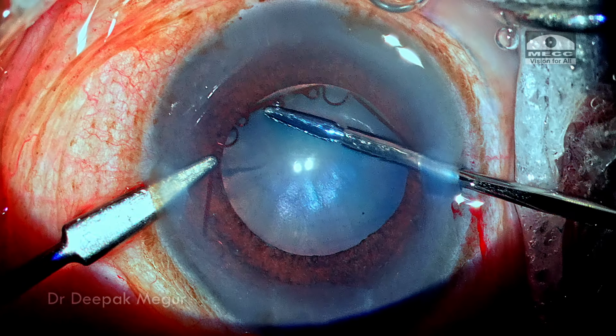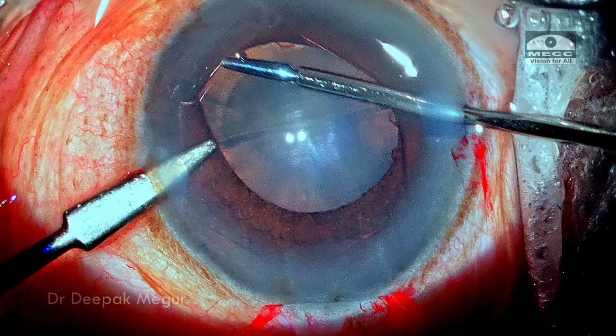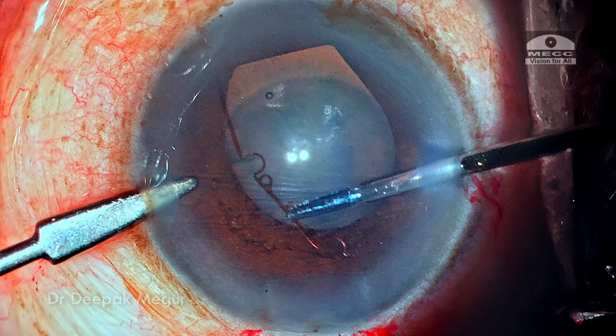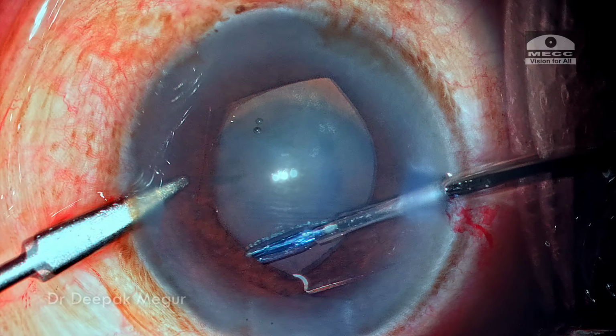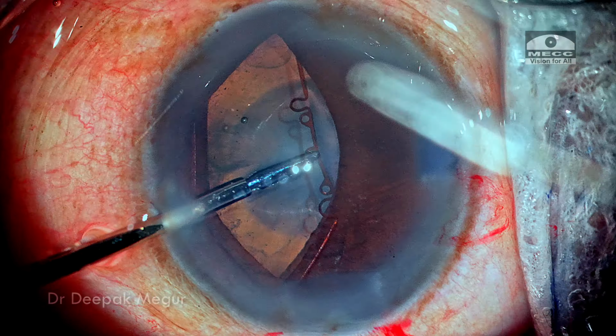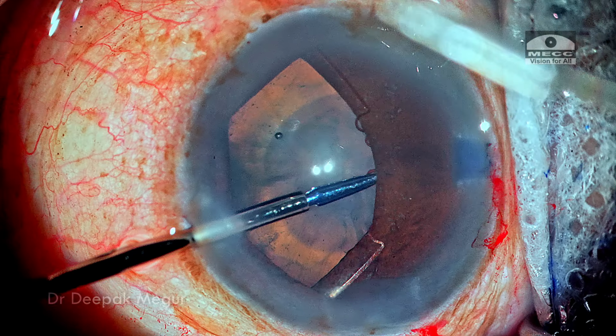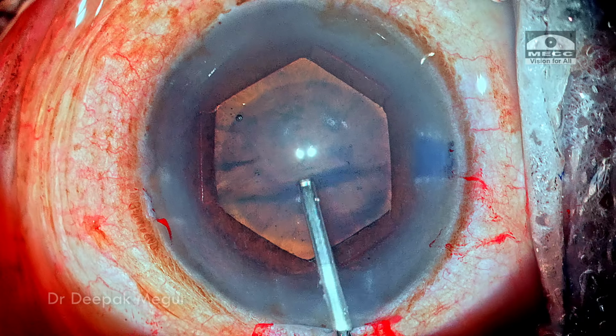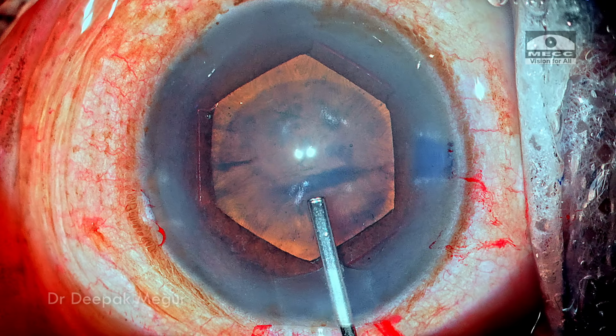The globe is stabilized and the first pair of notches is engaged into the pupillary margin, followed by the second pair. The hands are switched. The final pair of the notches are engaging onto the pupillary margin. The pupil is now decently sized and I don't have to bother about any intraoperative miosis.